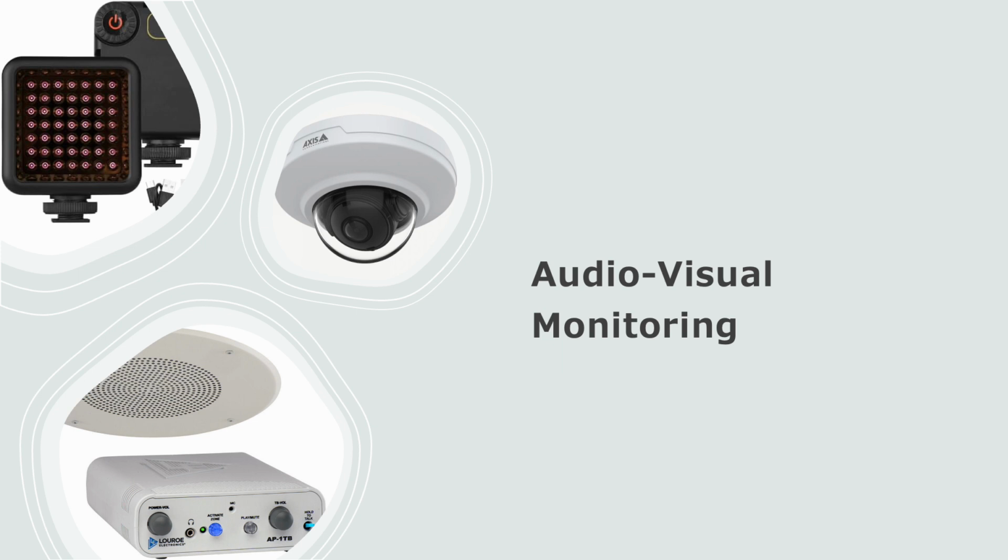Otherwise, there will be just a control box with zoom, tilt, pan control so you can move the camera to see the patient better. Some labs have a camera that doesn't move at all, and that can be annoying. The audio surveillance equipment can be handled a couple of different ways. Usually there is a control box that you can click a lever and talk to the patient, and you can hear them all the time. This may be different from the audio recording that is for the sleep study. In any case, you have to record audio during the sleep study, and you need a way for the patient to communicate with you in case of need for the bathroom or something like that.